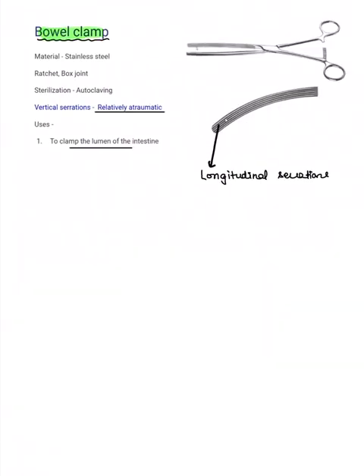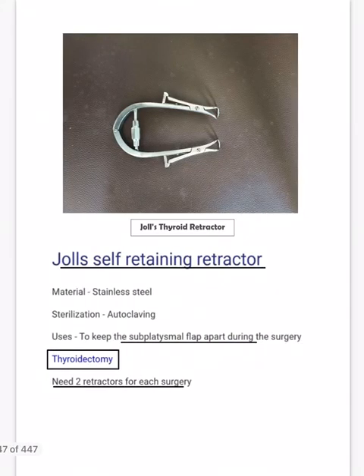This is again one of the more bowel clamps, guys. Okay, again, do you see, guys, how it is? So there is longitudinal serration. So this makes it relatively atraumatic, guys. Okay, and it is used to clamp this.